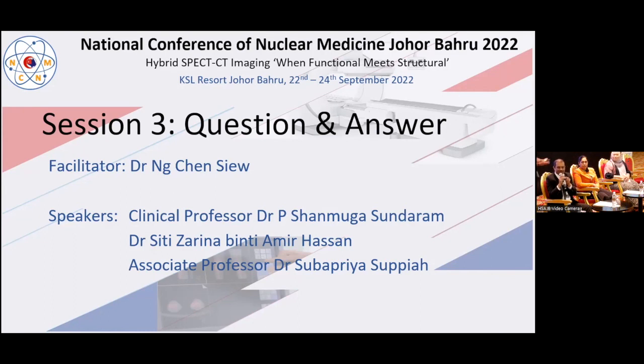But for our discussion purposes, to make it simplified, I will suggest initial image 10 to 20 minutes, delayed image 2 to 4 hours. The 1 hour image only in patients where you are looking for thyroid-associated pathologies. Otherwise, it is not really necessary.